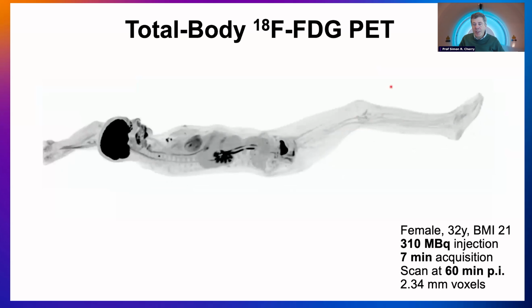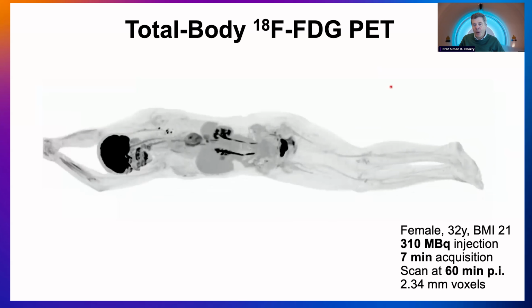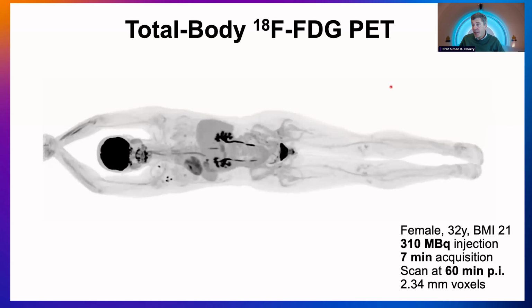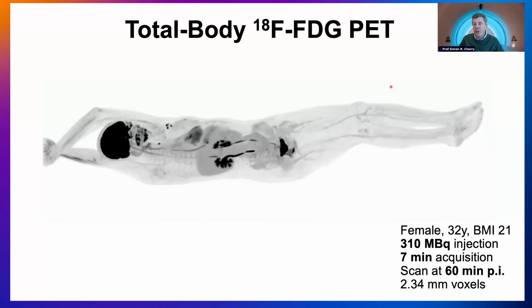But when we got the first scan, we were stunned. The images are just gorgeous in terms of their quality, very high signal to noise because of the fantastic counting statistics, means we can reconstruct a high spatial resolution as well.